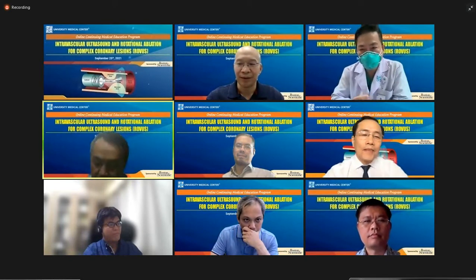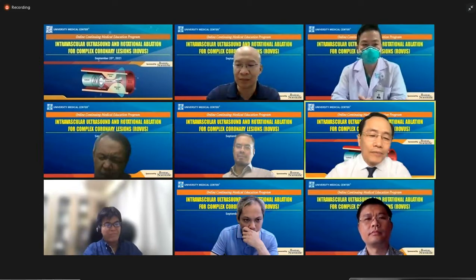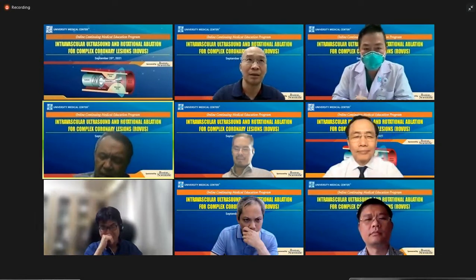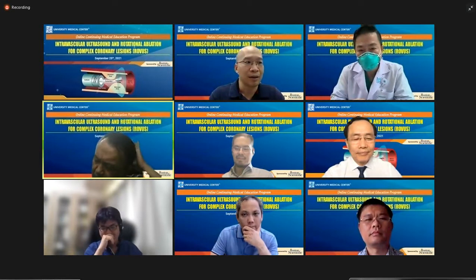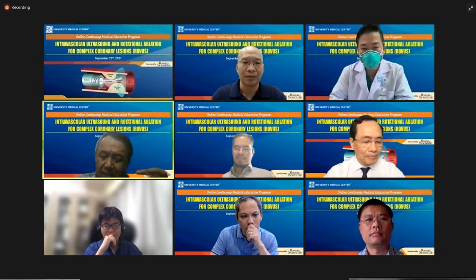Can you review? In this case, after you finish, I saw some malapposition in the left main. I don't see the stent fully apposed to the left main wall.